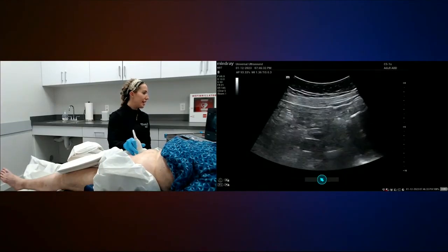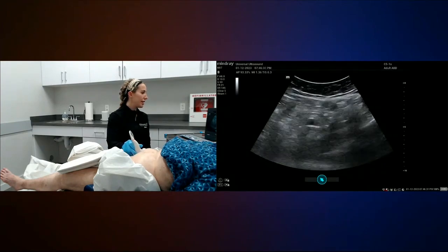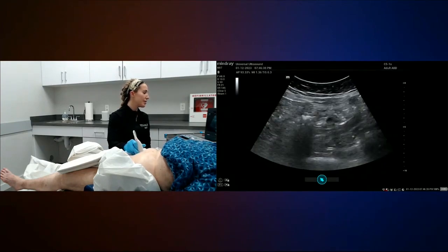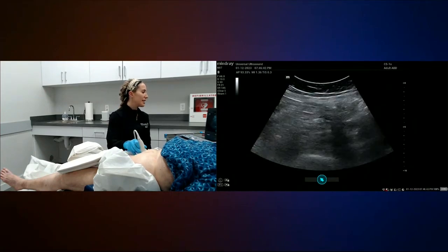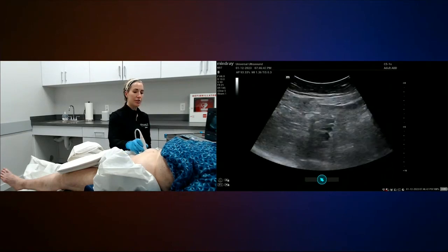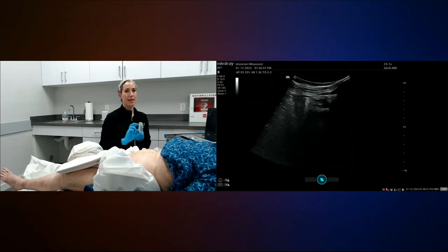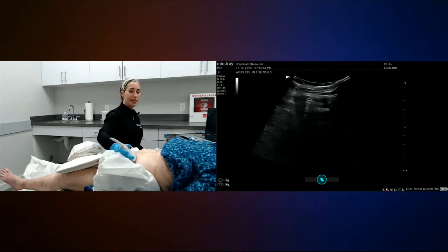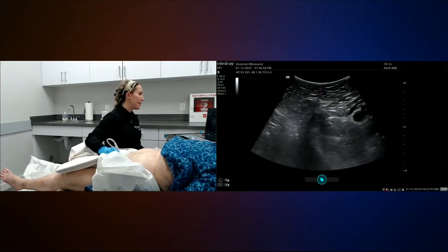But again, the things that are going to affect your venous waveforms, especially if you're in the hospital with vented patients, so sometimes that can be tricky as well. It gets harder to delineate what's normal and abnormal. So do the best you can to identify with color, B mode, and Doppler. Put all the pieces together so you can tell your story to the doctor appropriately. So let's go ahead and see what the left side looks like imaging from the pelvic.